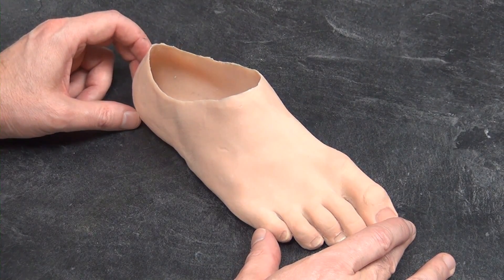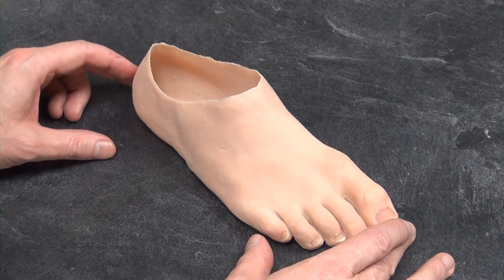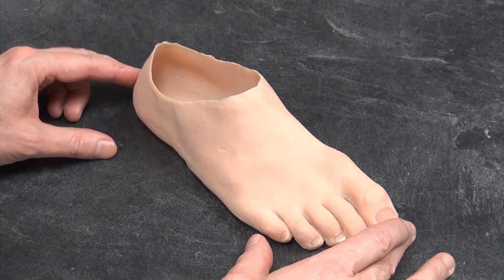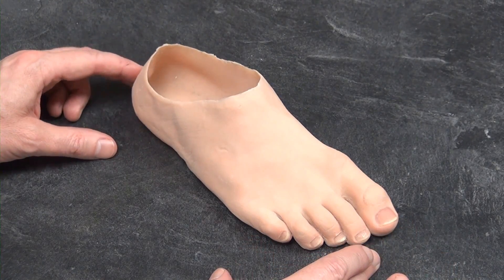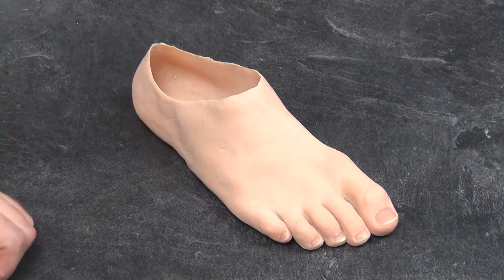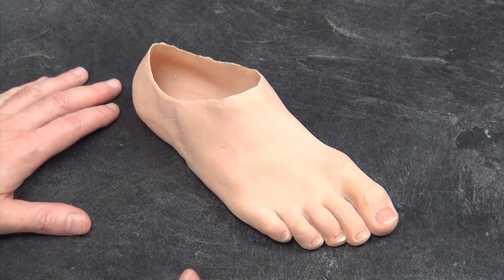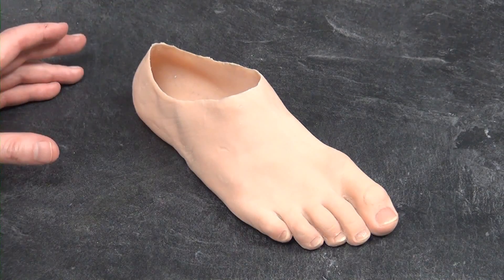We get a lot of calls and requests for information on this. It's a fairly unique prosthesis — only a few people in the country can actually make these. It's a blending of artistry and prosthetic skills, a little bit of everything, to get you a complete package that gives you nice aesthetics and function all in one.